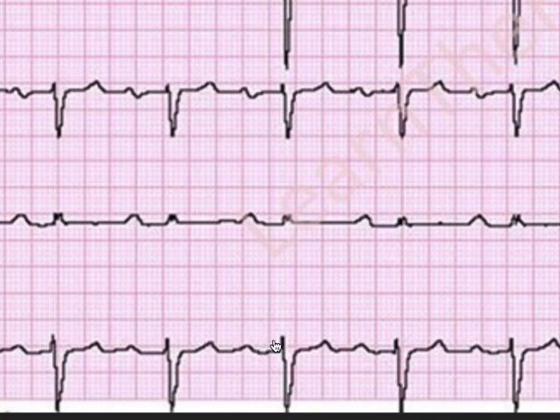It is more than 5 blocks, or you can say it is more than 200 milliseconds, or more than 0.2 seconds. Why? Because the PR interval is more than 1 block, so it is more than 0.2 seconds. Simply, there is a conduction block. The impulses which should go from the SA node to the AV node, then to the bundle of His and then to the ventricles, are taking so much time.